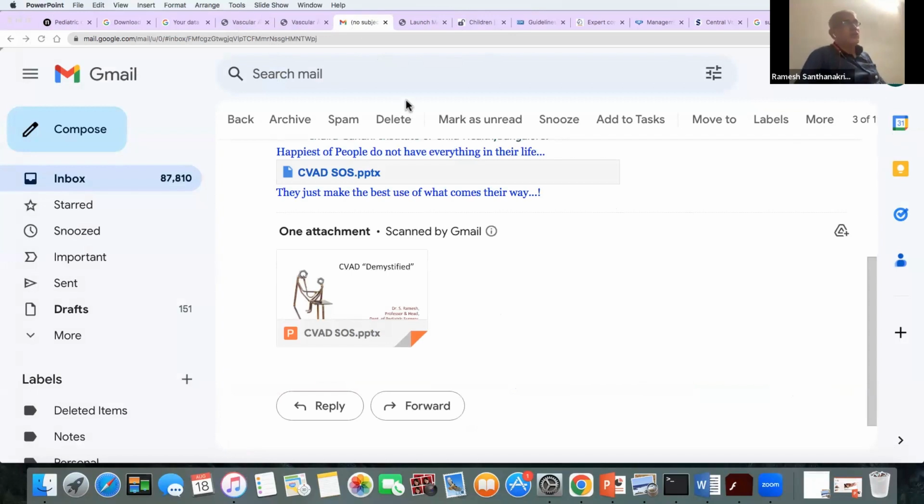So if there's no issues, no complication, you can flush it. Sometimes what we have done is we injected a little contrast to see if it is in the right place and if it is patent. You can just use a little IV contrast and put it in the port to see where the tip is and whether it is patent. So this also we tend to use, sir.